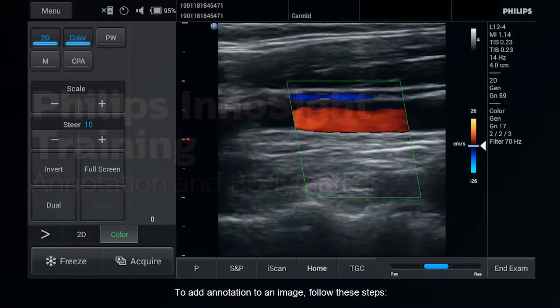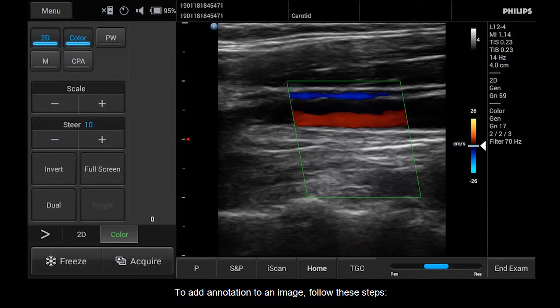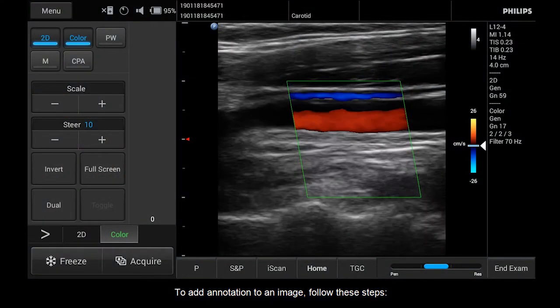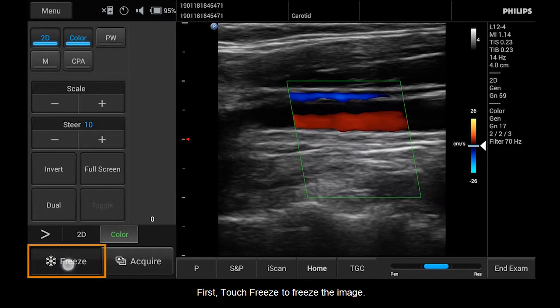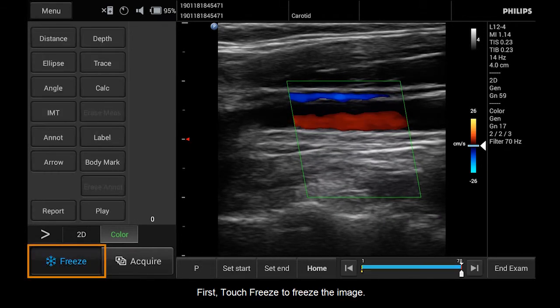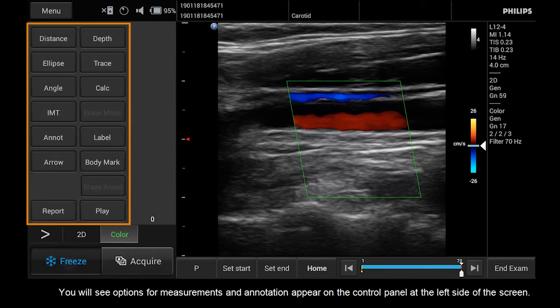To add an annotation to an image, follow these steps. First, touch Freeze to freeze the image. You will see options for measurements and annotation appear on the control panel at the left side of the screen.